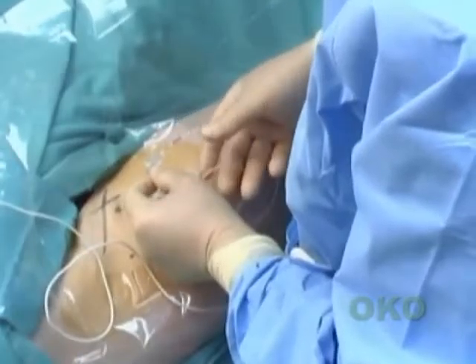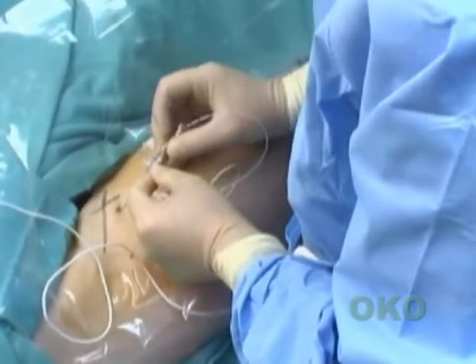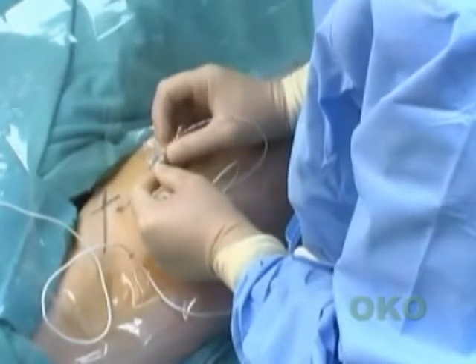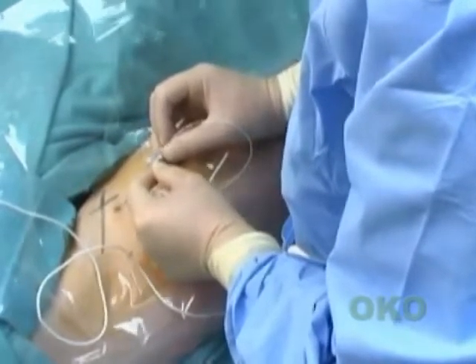The motor response will immediately start again, and the broad black mark on the catheter indicates that the catheter tip is situated at the tip of the needle, but it is not yet protruding from the needle tip. The needle should never be manipulated if this broad black mark is not completely visible. In the case of this demonstration, the muscle twitches continue at a nerve stimulator output of 0.42 milliamps during catheter advancement. This indicates that the catheter is following the nerve, and this assures correct catheter placement.